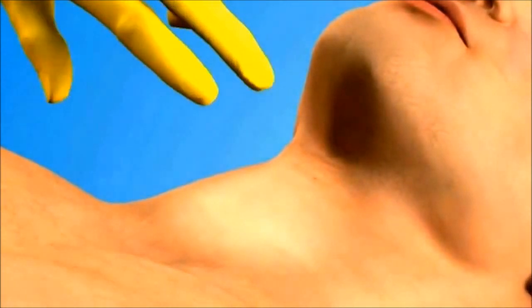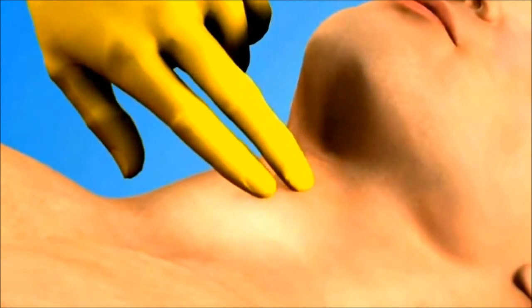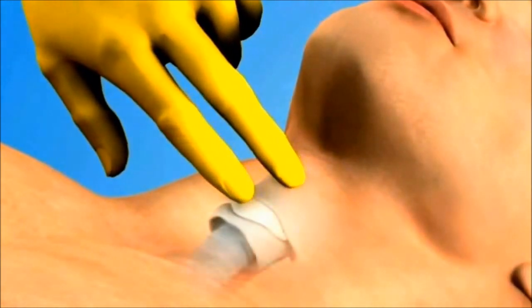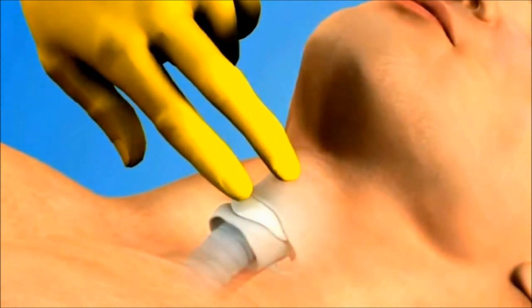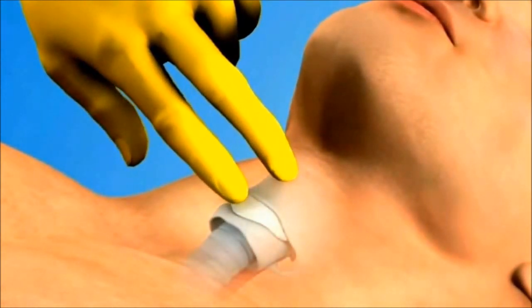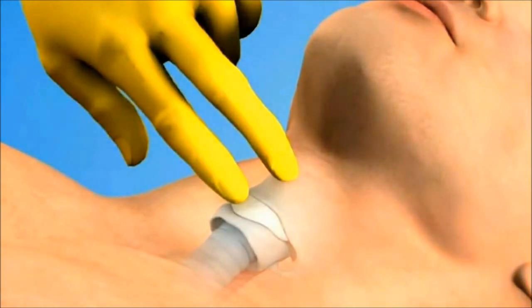Locate the cricothyroid membrane using your non-dominant hand. Remember, the membrane lays inferior to the prominent thyroid cartilage.